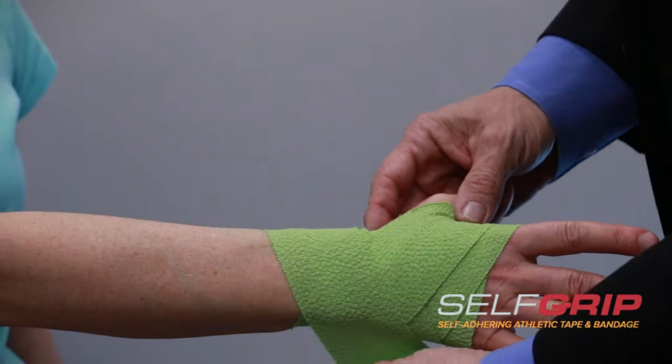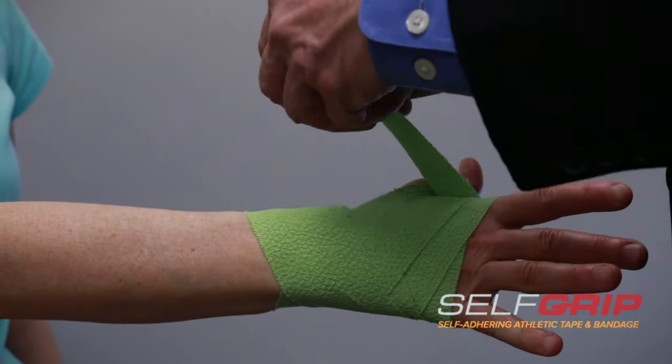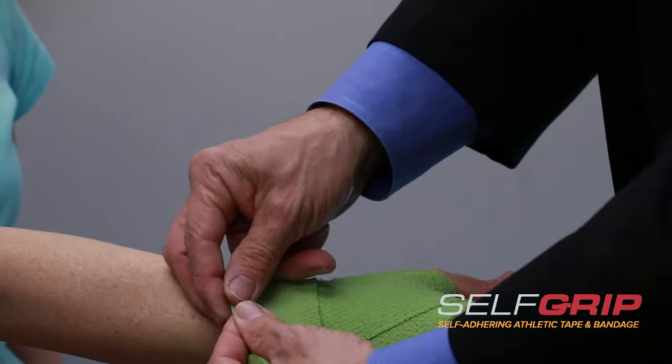And then we're going to do one last one to make it nice and secure, and we're going to finish it off with a little bit of a lock on top.